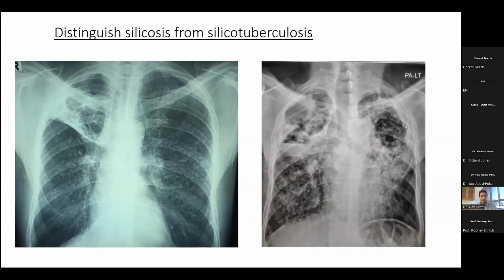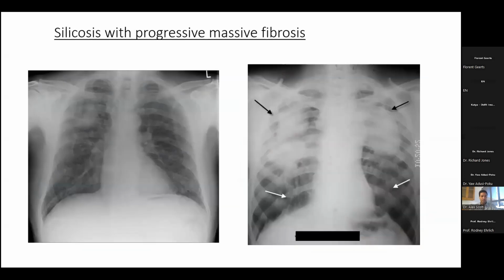The other X-ray is extremely difficult. We can see lots of nodules, large nodules of different size. There seems to be an air fluid level, possibly the filling of a cavity. Maybe there's a fungal infection in there. There's pleural thickening. So this is a problem facing readers, and it's a problem facing CAD. And finally, of the pictures, next slide, please.